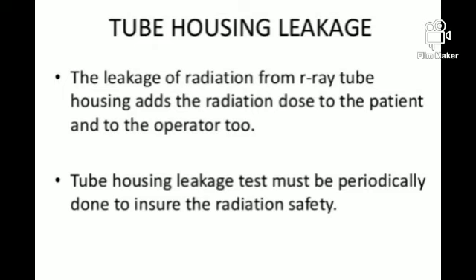Now the main question is, when do we actually do the leakage radiation test? We do it periodically to record the doses in the area, and mainly we do it during the installation of the machine, after the installation of the machine, and after any repair of the machine. So I hope it is clear now.